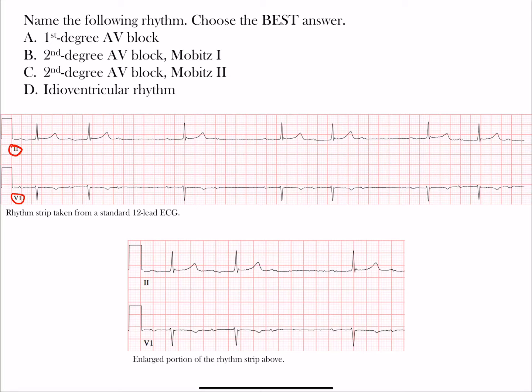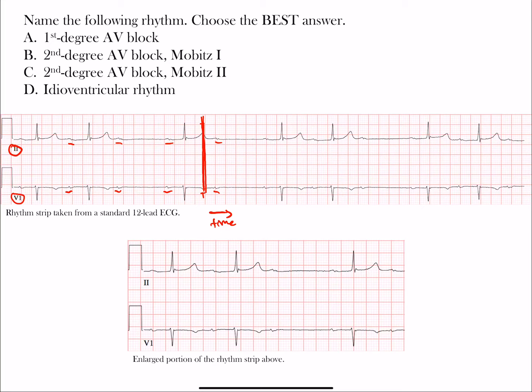The P waves are a little hard to make out but they are there. Here's one, and there's one — you can see these throughout. This right here is a T wave. Remember there's a temporal relationship with different intervals, waves, and segments on the ECG. Anything happening above or below is happening at the same time — time on ECG goes from left to right. That's why this QRS complex happens at the same time.